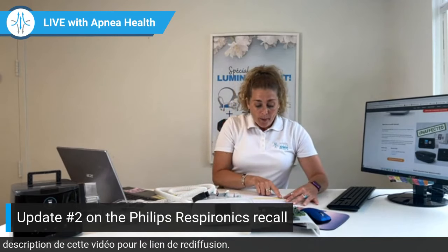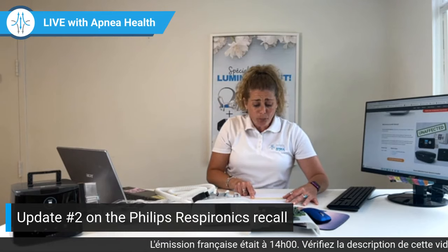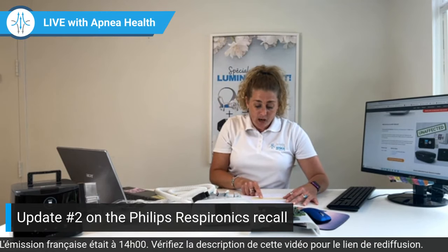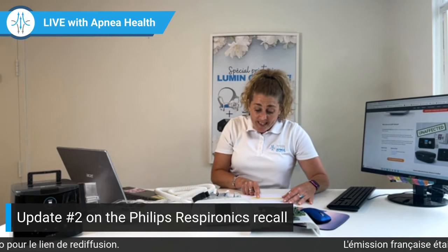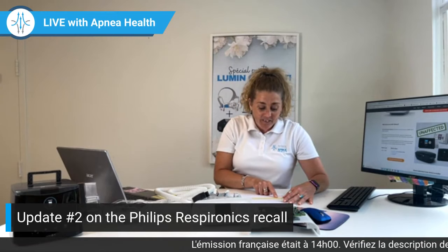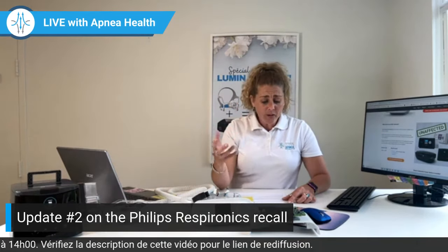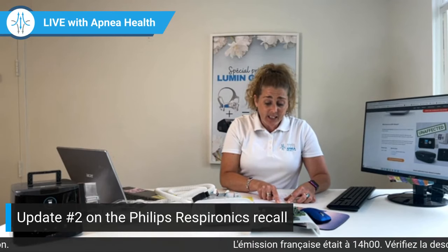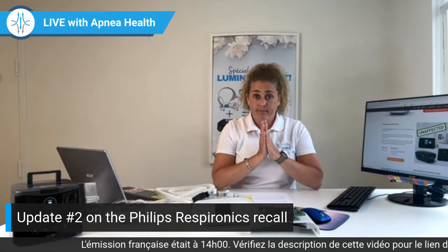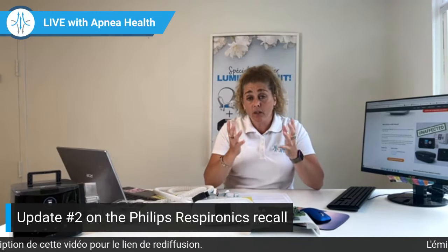Okay, and I quote: for patients on bilevel PAP or CPAP devices who have severe breathing difficulties or were very sleepy during the daytime before treatment, have significant pulmonary, cardiovascular, or neurologic comorbidity, or who work in safety critical positions such as professional drivers, pilots, heavy equipment operators, we would recommend that they not stop their prescribed therapy until first discussing with their physician. So again, 0.03%. And this quote is from the American Thoracic Society. So that's a relief to know, guys. It's good information. It's positive information for you guys.